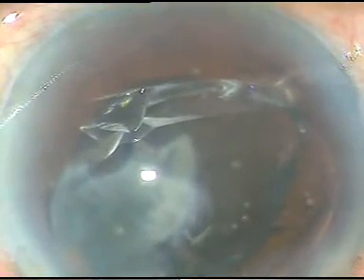Since there is posterior capsular rupture, I want to keep my left hand free in case I need it for supporting the epinuclear material or anything.